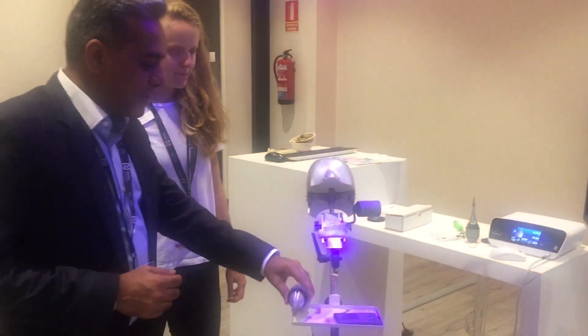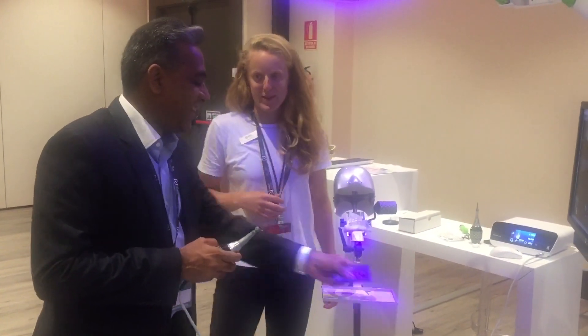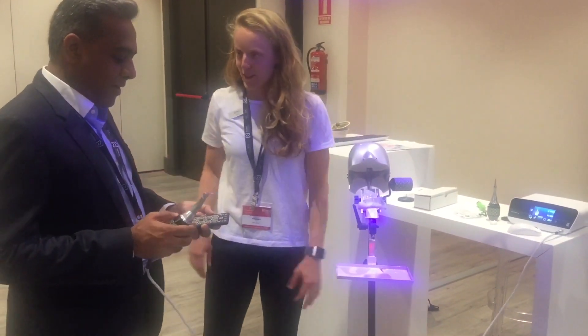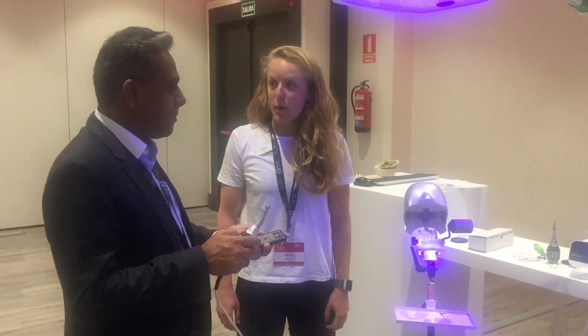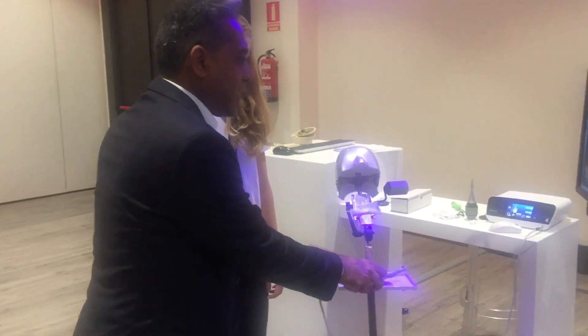Right now we are looking at one of the most exciting things in dentistry. I would like to take credit for developing the product — I'm one of the engineers who helped test the product early on. So you're basically the director of this? I'm the product manager for XGuide. So Katie, just tell me, how does it work exactly?